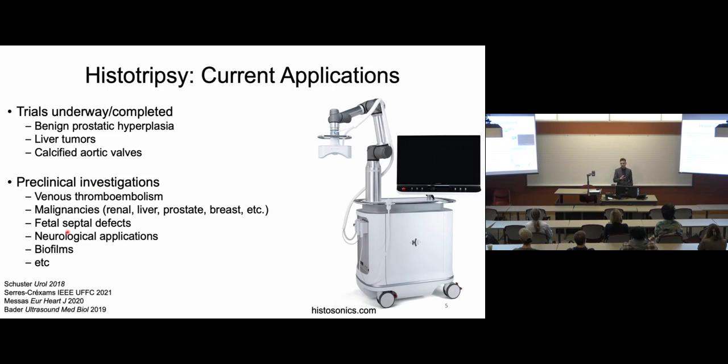What's been exciting over the past, I would say, 5 to 6 years is that it started to transition from this preclinical modality that's being tested on the benchtop into clinical trials that are either currently underway or have been recently completed. I've listed each of those clinical pathologies being tested clinically over here. On the right-hand side, this is actually one of the commercial systems that's being tested right now.